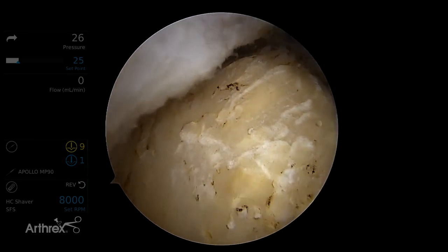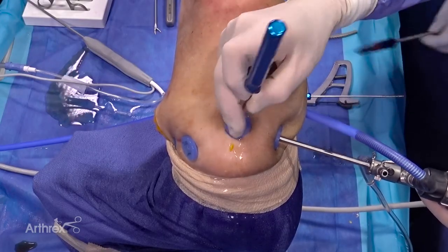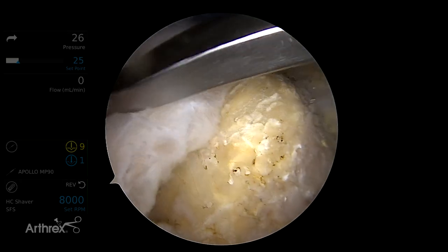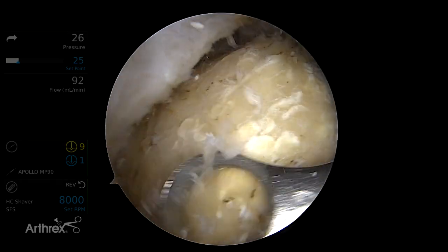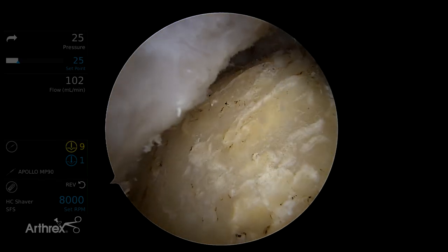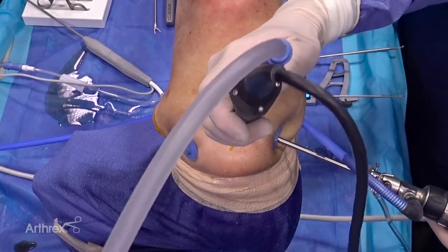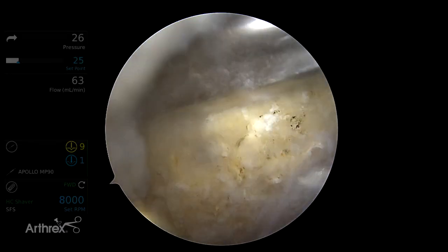I like to prepare the footprint, and I've done some of this already — removing the soft tissue. I like to use a curette first to help remove all the soft tissue from the previous fibers that might be left over, to get a nice little bleeding, decorticated area. And then I also like the power rasp, so here's our power rasp.